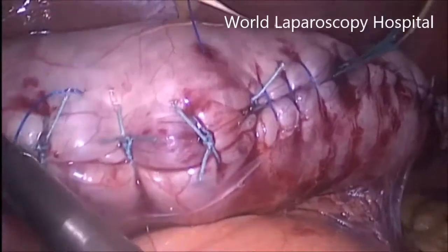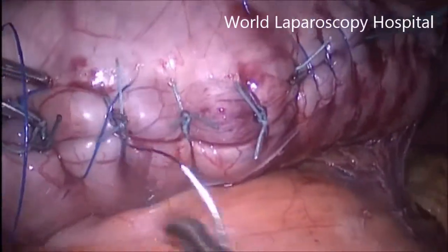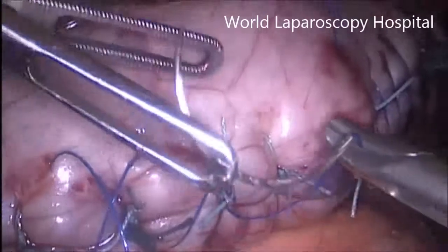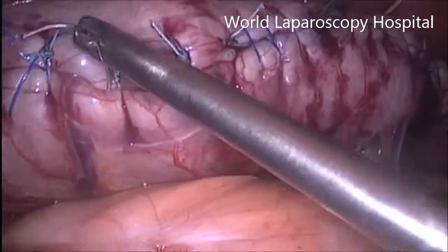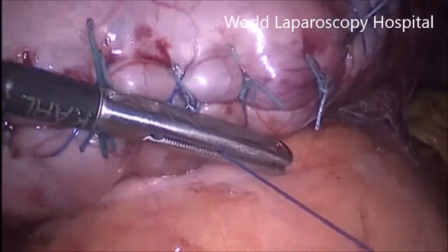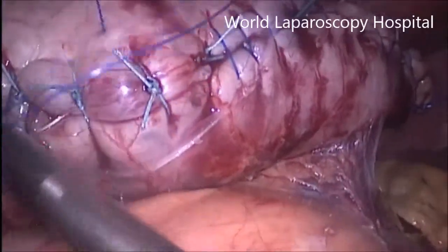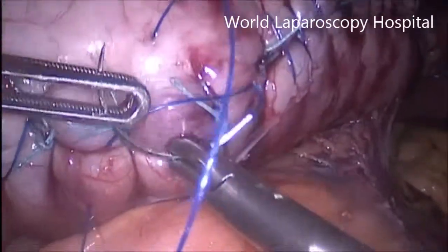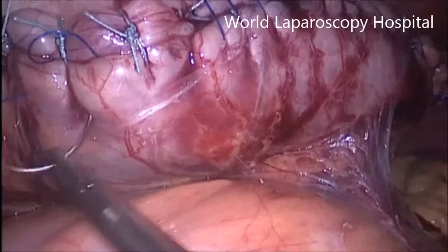This is the first suture. Generally, locking is not done in this continuous suturing because at the end you have to pull it all to make it tighter. So, this is the last row here. You pull it, and then again continue. This is the last row of the suture with the Proline. One O you can use. And that will be the end of the plication.